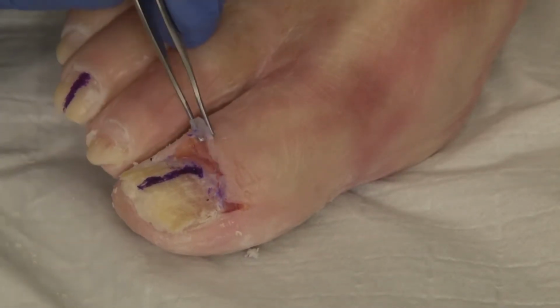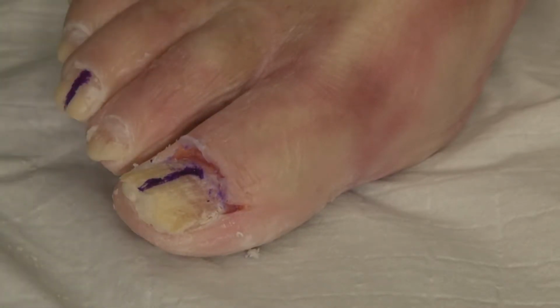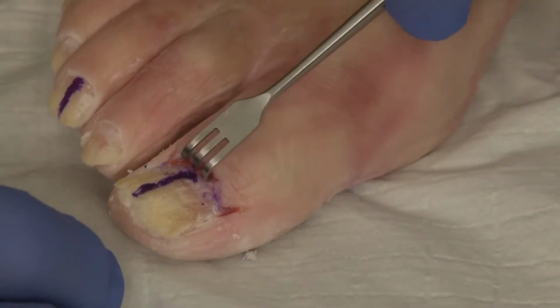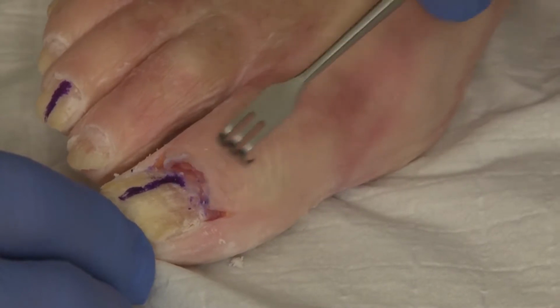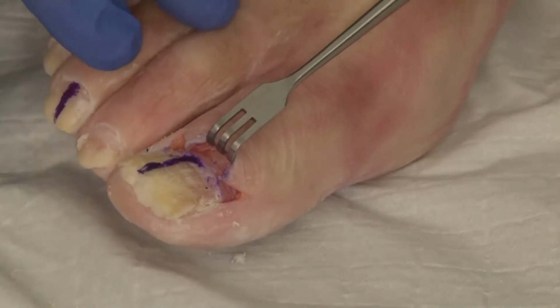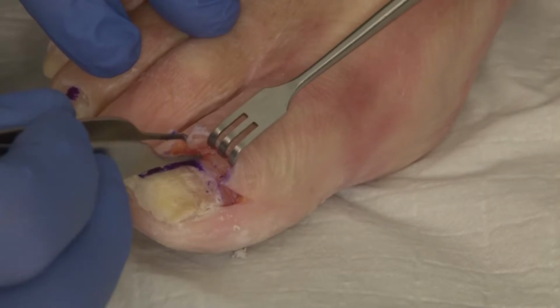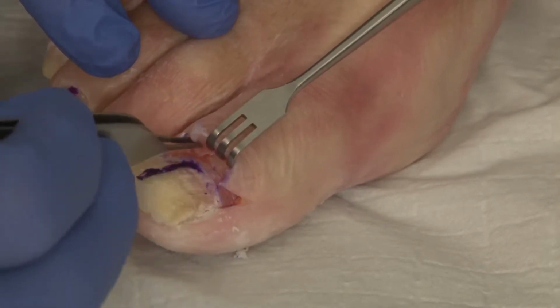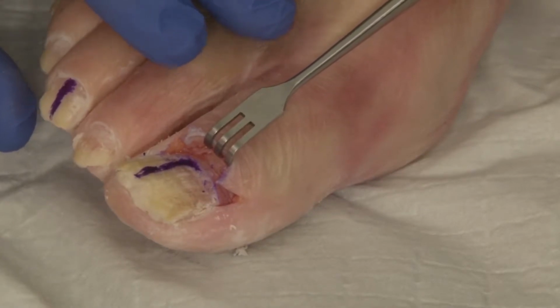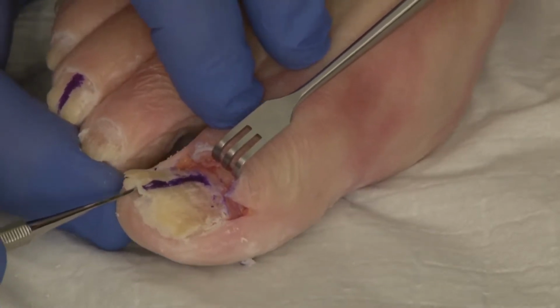It is up to the choice of the surgeon whether or not you want to do a nail avulsion to gain access to the matrix. However, underneath the proximal fold, the nail plate is very soft, and you can easily get through it if you decide to do a punch biopsy in this area. But since we are going to do a matrix shave, it is necessary to remove the nail plate, which we will do now.